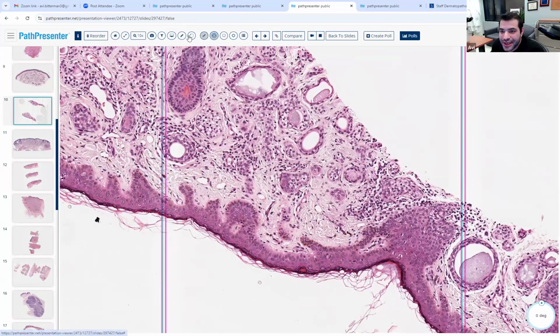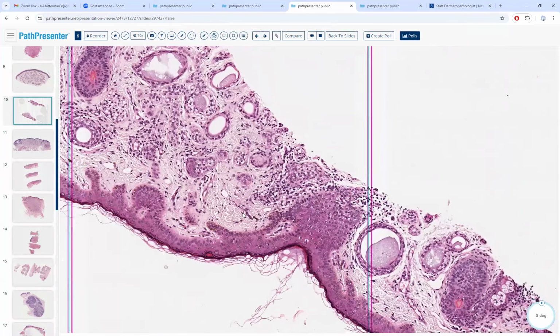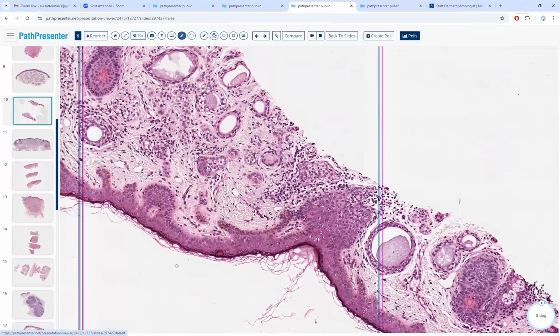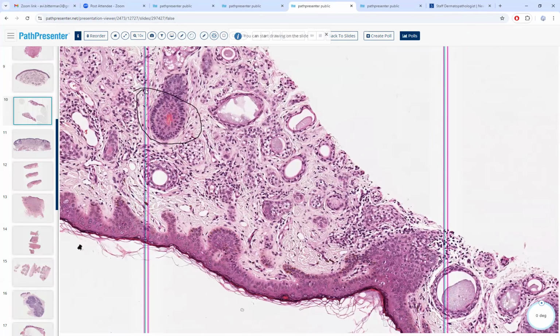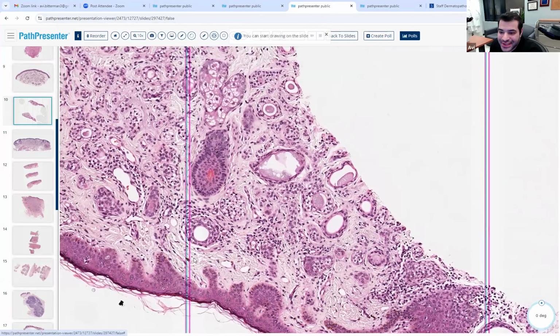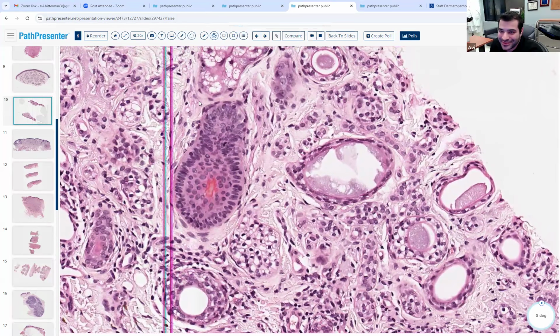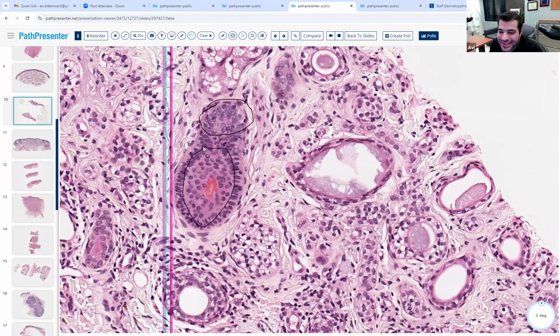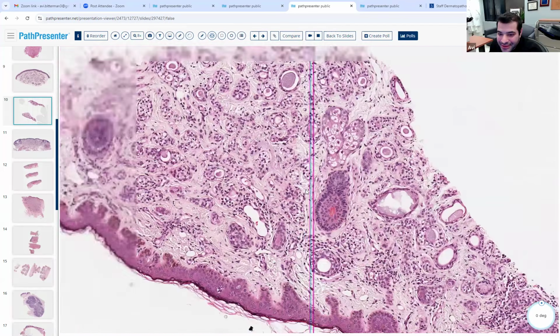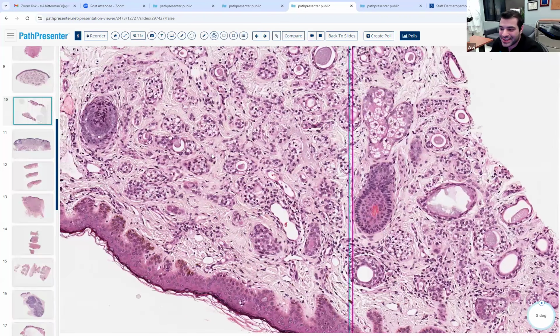Are you talking about this area? No, a little bit up, like 10 o'clock of where you just circled. Like where there's the red center there. Oh, you mean this structure? Yeah, is that palisading? That's a hair follicle. Look, you see how this little area, and this is almost reminiscent of that, see how you have this over here? Then you have this other structure here. That's just a little hair. So is this, and so is this. That's not the tumor, but see how that's different from the rest of the tumor?